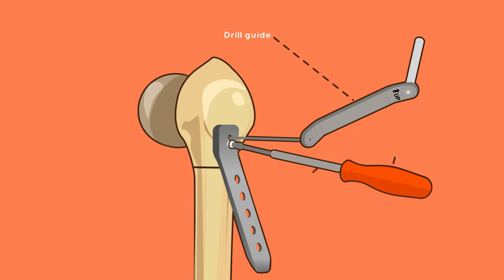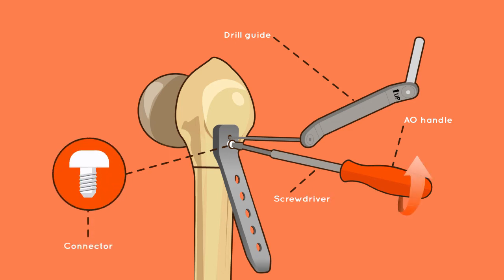Attach the AO handle to the screwdriver and lock the blade plate assembly by threading the connector clockwise through the plate into the blade as tightly as possible.